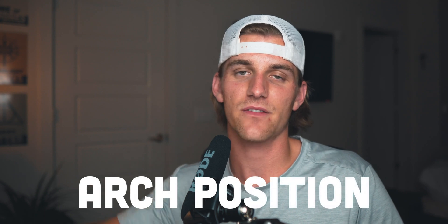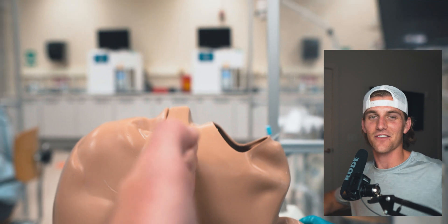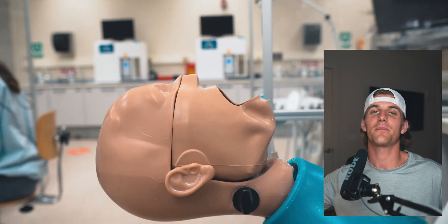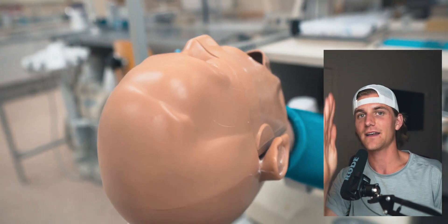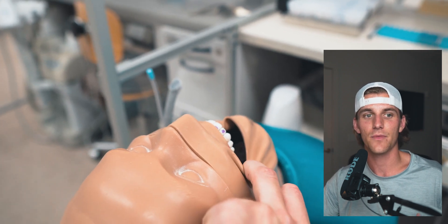I want to note the posture of the patient. As the operator I want to be sitting at roughly the 11 o'clock position if right-handed like I am. The other important thing is patient position — we want the maxillary arch oriented essentially perpendicular to the floor. We want the patient's head back so their maxillary teeth sit at a direct 90-degree angle to the floor. This gives us really solid access and helps us maintain straight angles — keeping the bur in the long axis of the tooth and all angles at 90 degrees. Also keep the patient's arch within your working range so you can see through the mirror, and make sure your loupes are fit to your correct working distance.